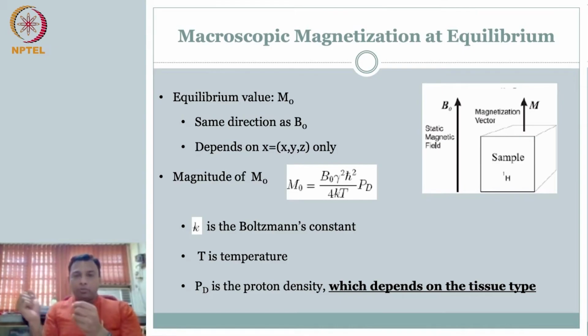You take this sample volume, put it in the external magnetic field. Initially, each of the nuclei are in different random directions. So give it some time. After you give it some time, every nucleus is trying to align, if it is hydrogen, to its up preference at 54 degrees. There are more of them, or it is going to be 180 minus 54 the other direction, but there are more in the up direction. So you have a net magnetization after you leave it. This is called M0, the equilibrium value. So that is the net magnetization at equilibrium from that sample.